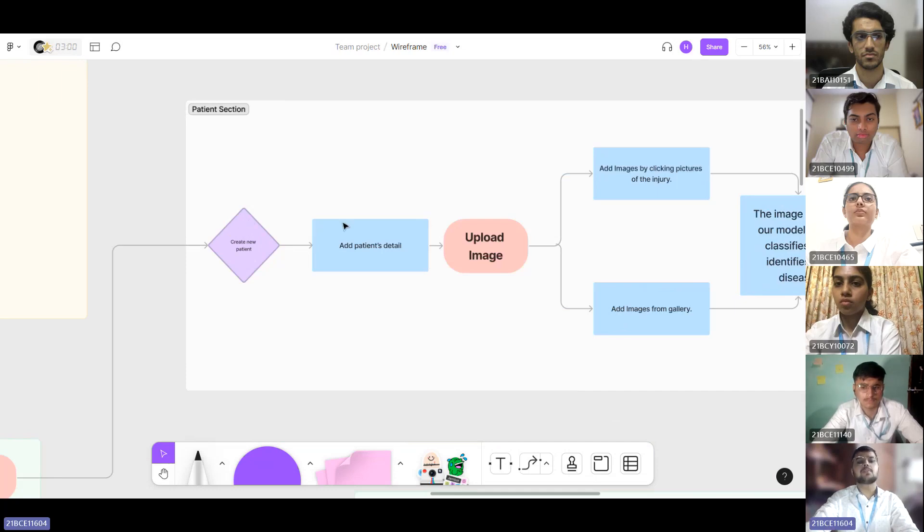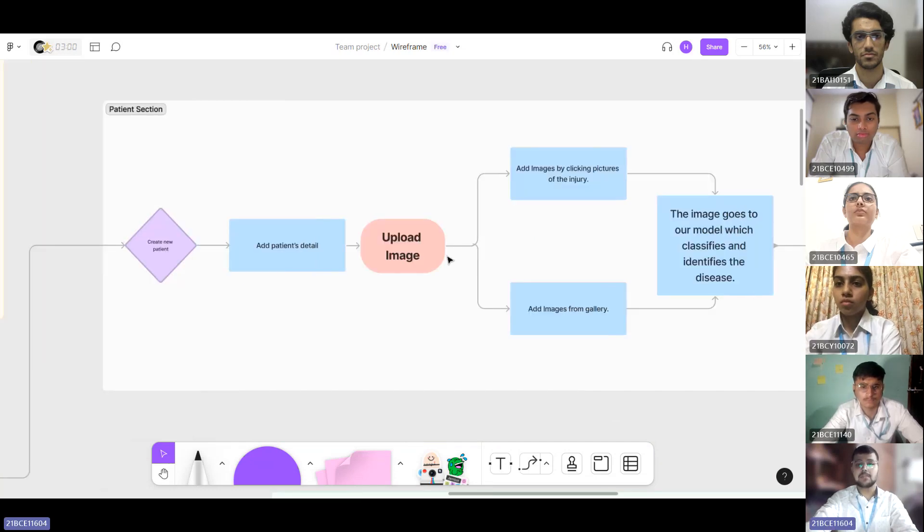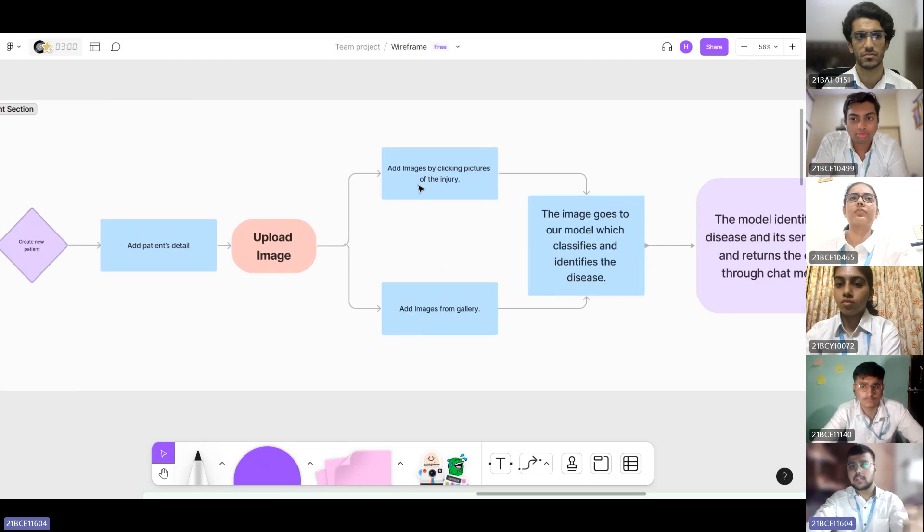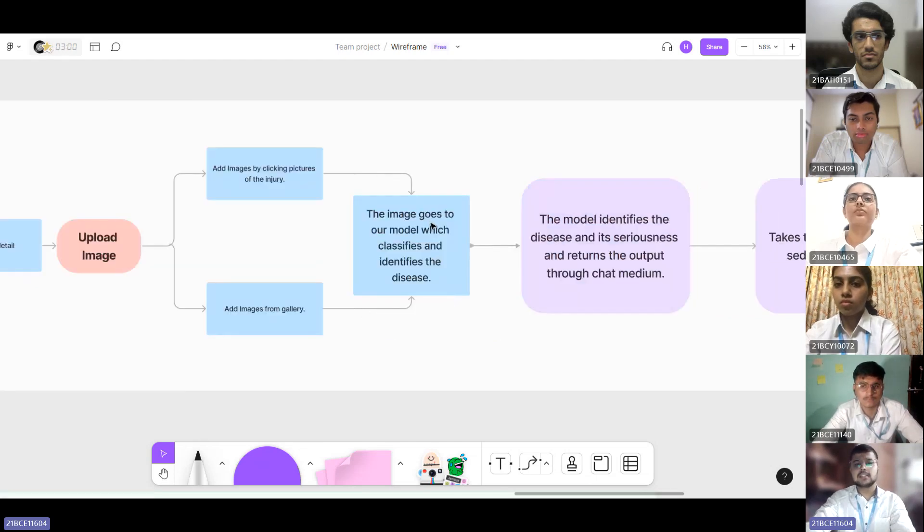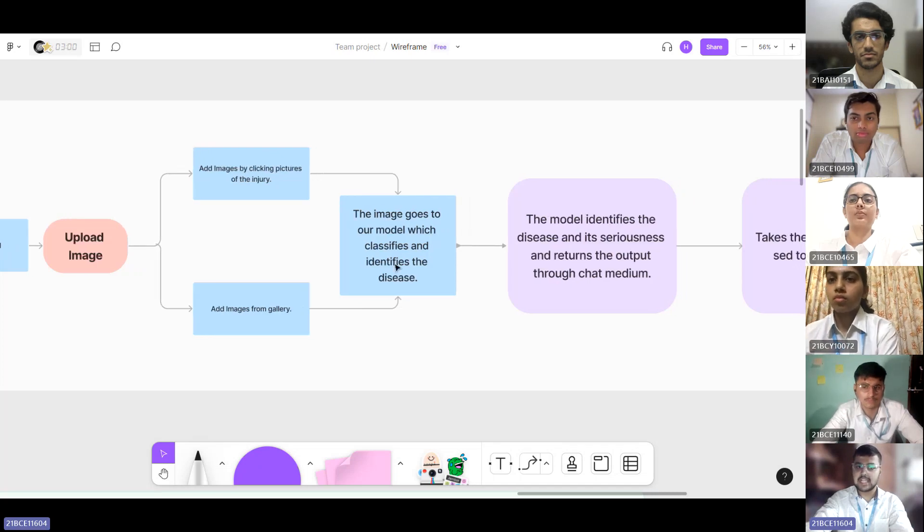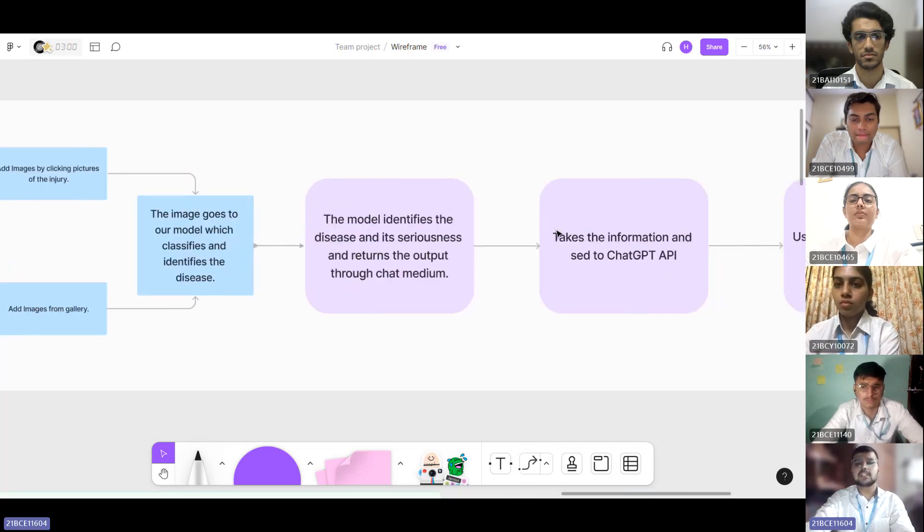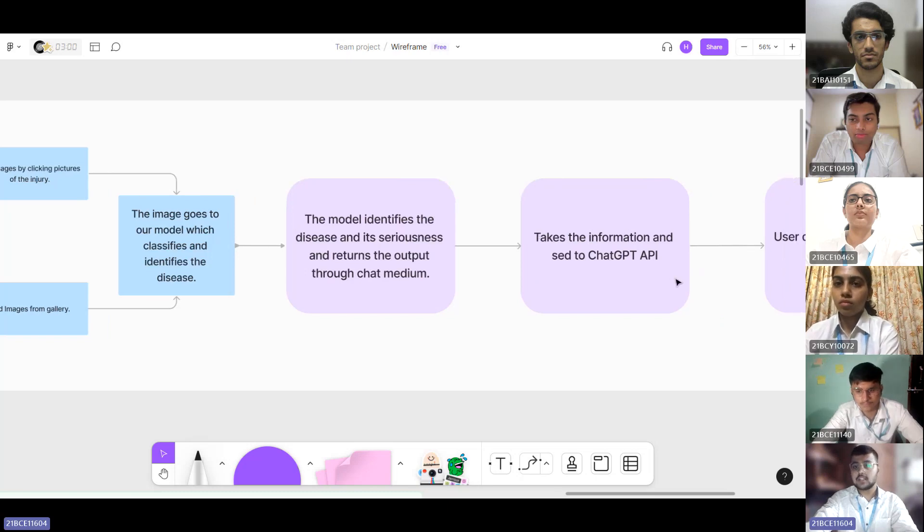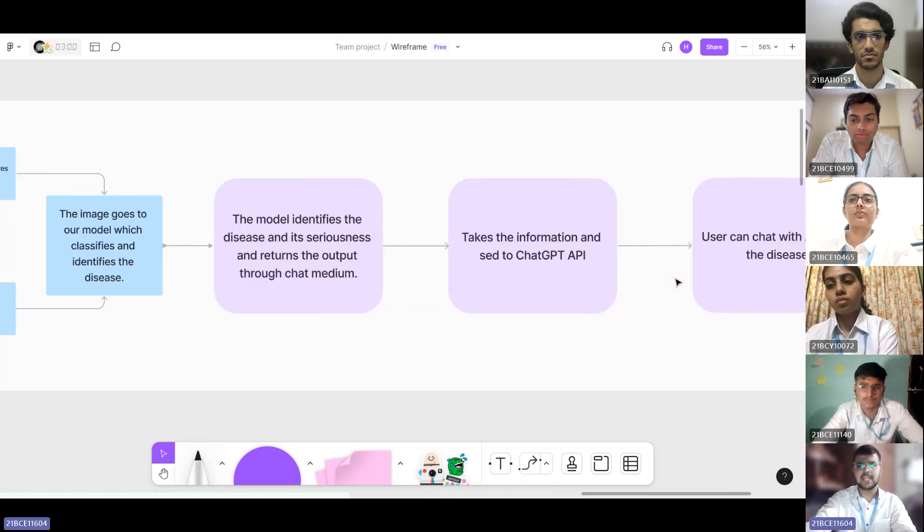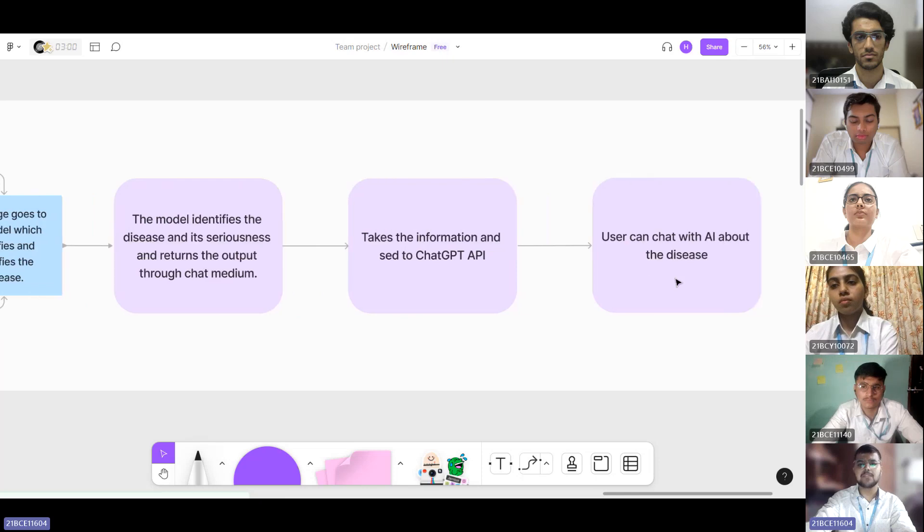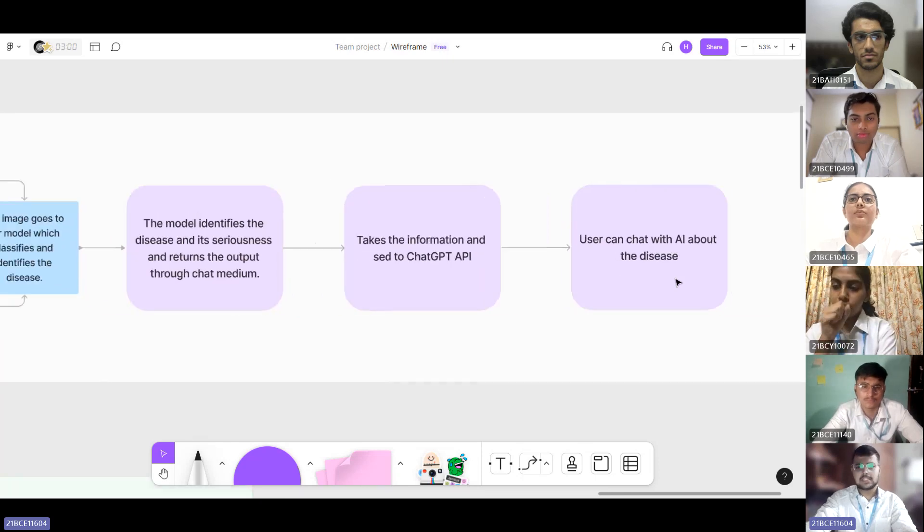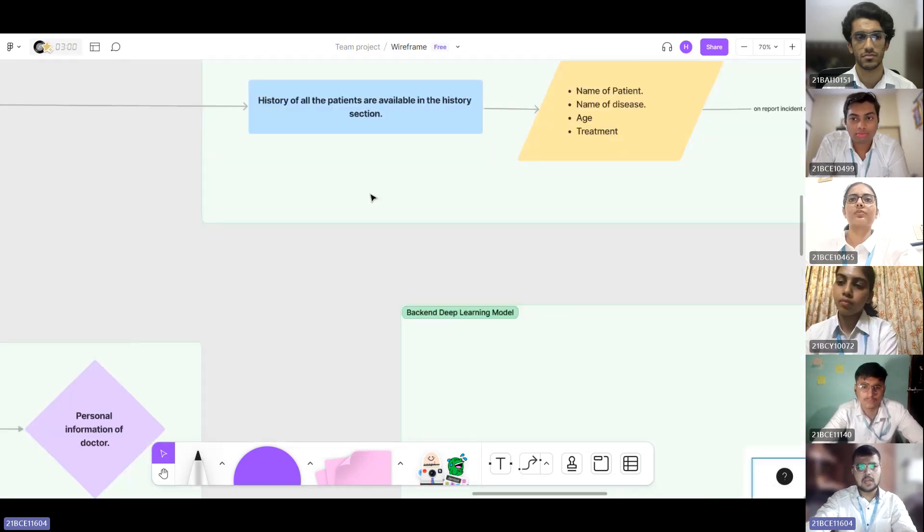If the user chooses this option, we move to this page where a new patient's profile can be created. Image can be uploaded from live camera or from the gallery. Then the image goes to a model. As Nathesh mentioned, it classifies the disease and identifies it. When the disease is successfully identified, the OpenAI API, which we can also call ChatGPT API, takes over and the user can chat with the chatbot regarding any discussions or needs to clarify.